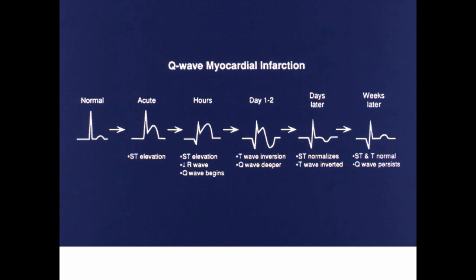So here you can see ST segment elevation. Look at this TP segment. This is the TP segment and this is the ST segment, and both these are on the same line. So here the ST segment is normal, but here look at this. This is the TP segment and this is the ST segment, and ST segment is well elevated above the TP segment. So this is ST segment elevation.